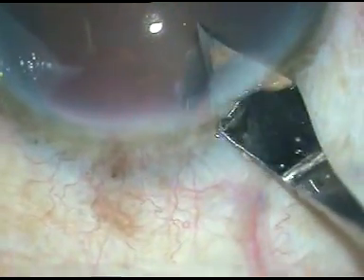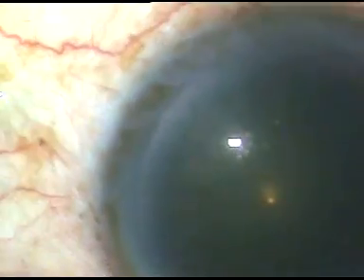Colleagues, in this video I am going to demonstrate a very good technique of initiating capsulorrhexis.